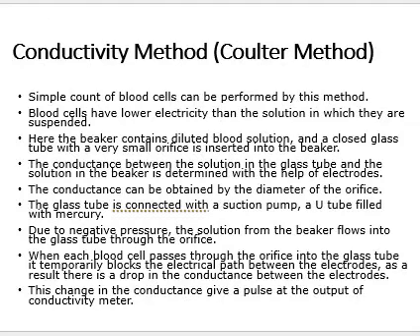When the switch is on, current flow takes place, and when the switch is off, the current flow stops. So we can see on, off, on, off: the number of times it is made on and the number of times it is made off.